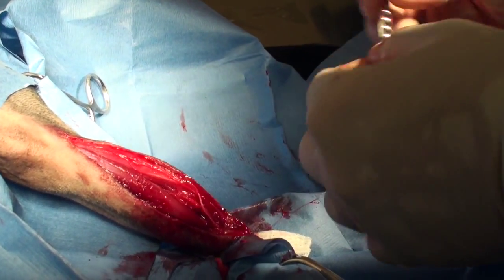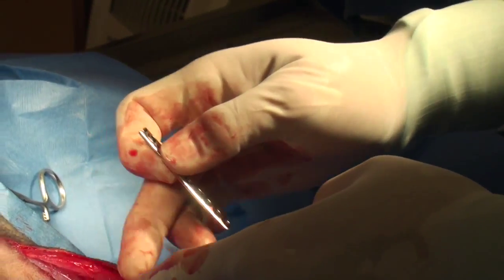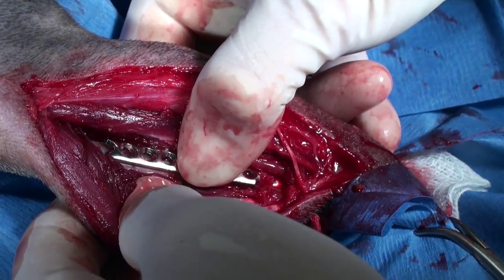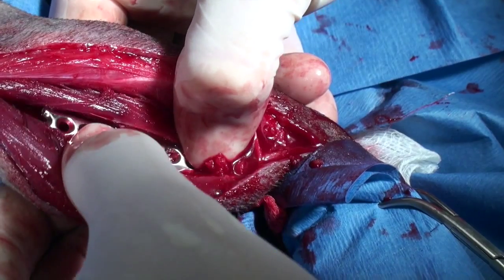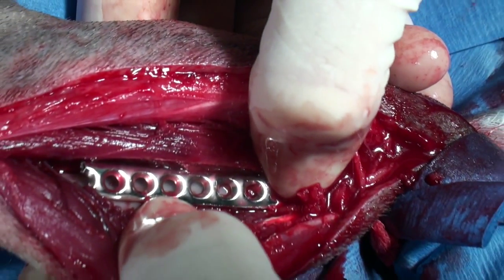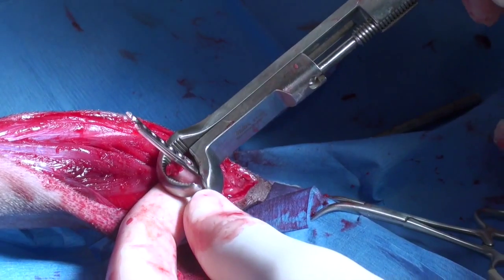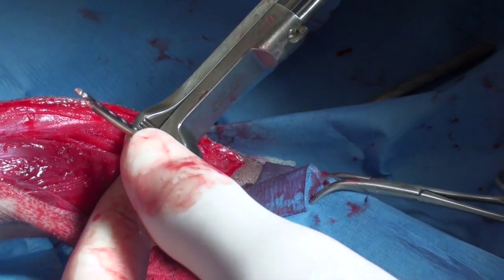Done — this is going to be the plate. Now we need to bend it according to the shape of this particular tibia. We're presenting the plate and we're having a good bite there. We're preparing now to drill the first hole, which is the most important hole because it's the one that's going to anchor the plate.